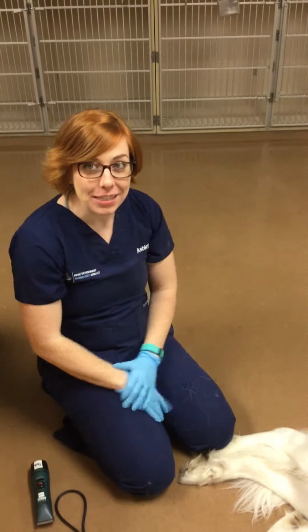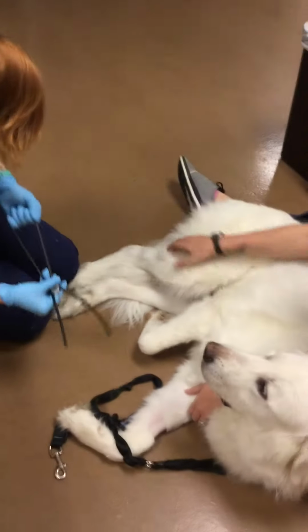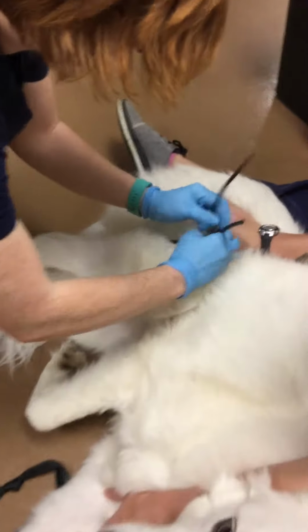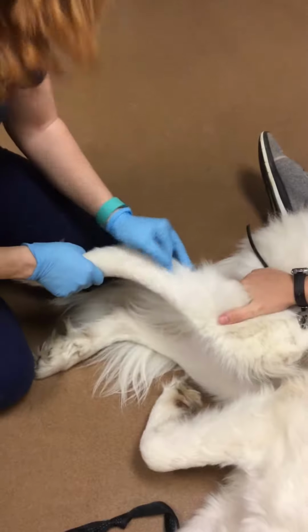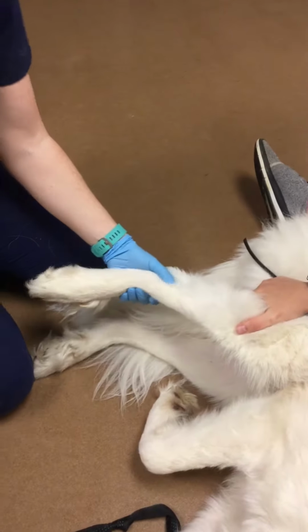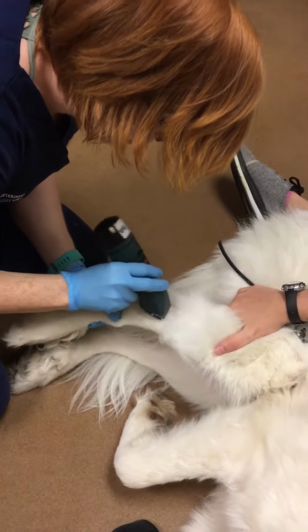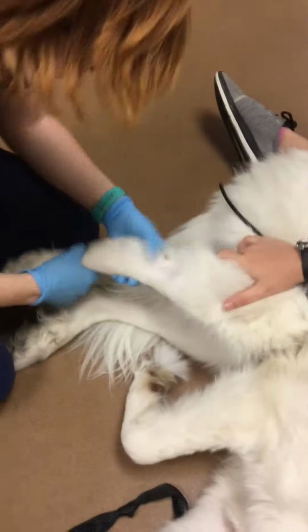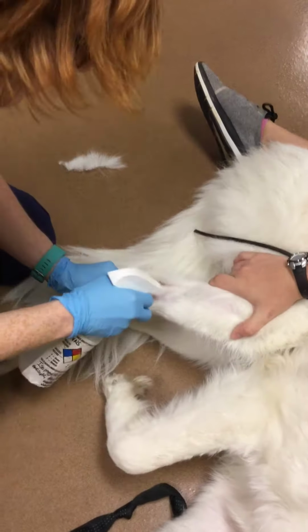This is Ashley Anderson. This is task 1, making some serum. So I have Bentley here, so I'm going to use a tourniquet to let the vessel pop out. Then I'm going to just clip a small area so that I can see the vessel just a little bit better. So you can see it right here. Then I'm going to spray it with alcohol.